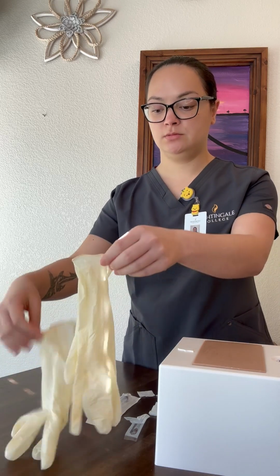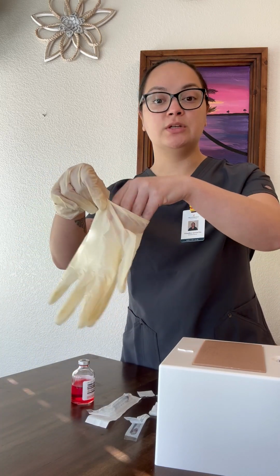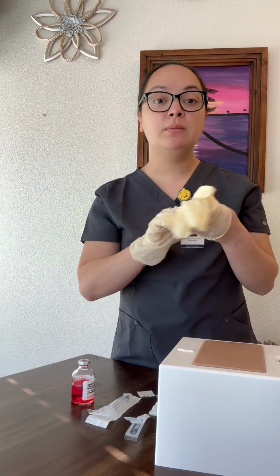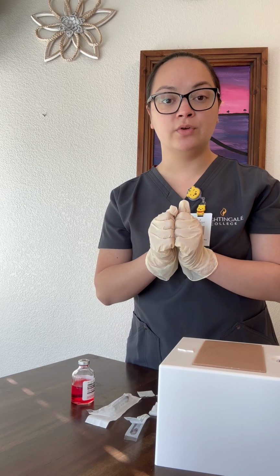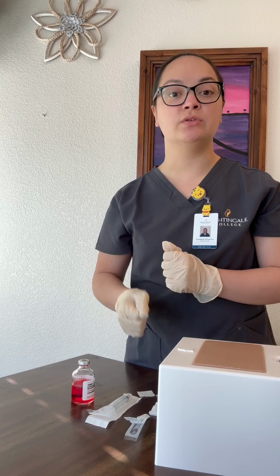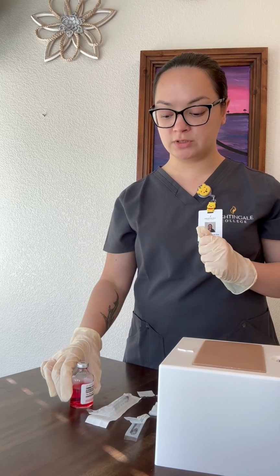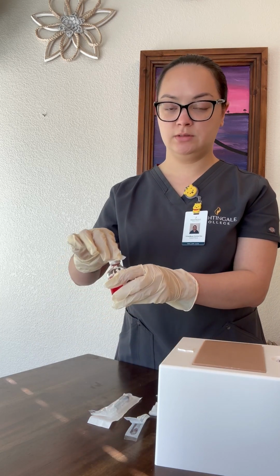I will go ahead and hand hygiene, apply clean gloves. For this syringe, we're going to be using a 3 milliliter syringe, and the gauge will be 25, and the needle for intramuscular injection should be about, for an adult, 1 to 1.5 inch needle. We'll be using a 1 inch needle. So first, we'll go ahead and clean the vial with alcohol and discard.